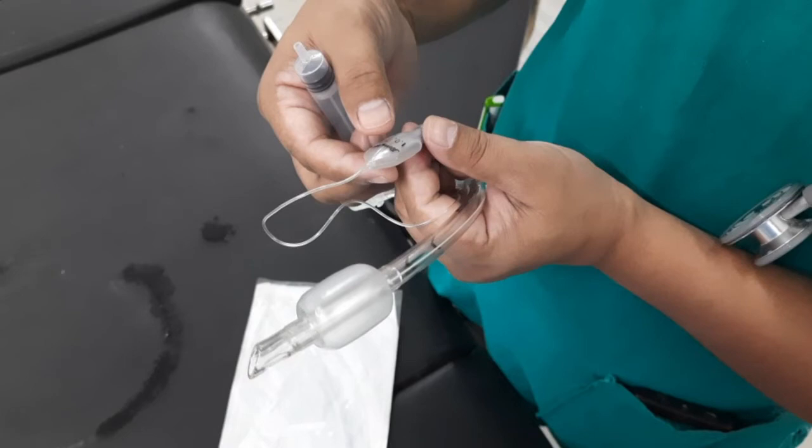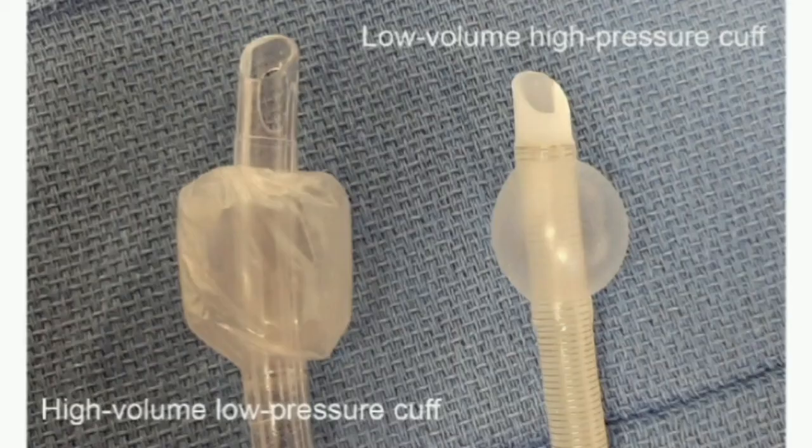High volume, low pressure cuffs have a larger surface area in contact with the trachea. This means that they apply a lower pressure against the tracheal wall and have a lower incidence of tracheal wall ischemia and necrosis. However, the seal is not as good as that of high pressure cuffs, because of the lower pressures and because the large cuff may develop wrinkles that allow material to pass by the cuff.